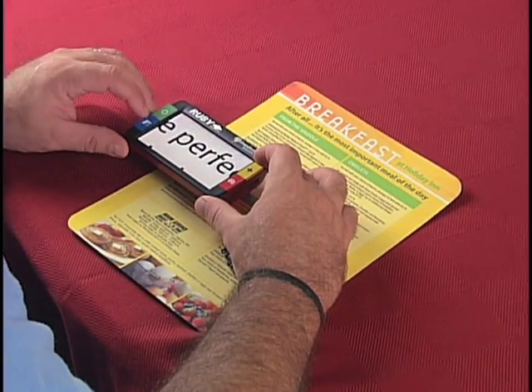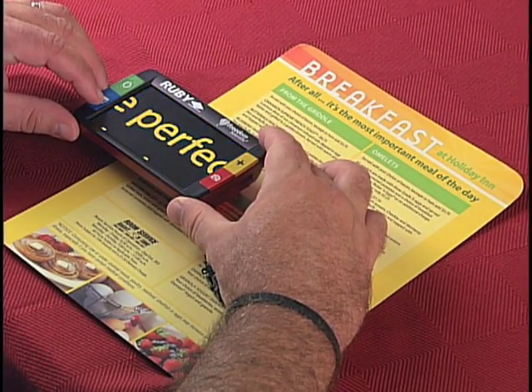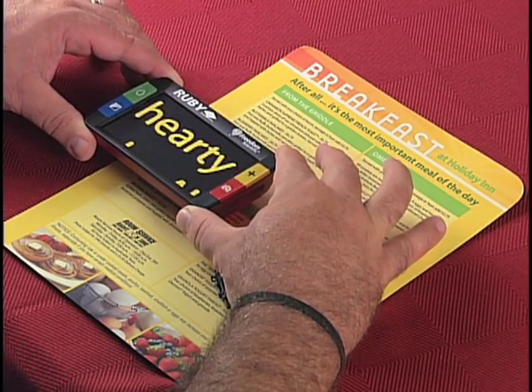I just place it on my reading material and adjust magnification and contrast for the most comfortable reading. I use it to read menus, the yellow pages, the newspaper, anything.